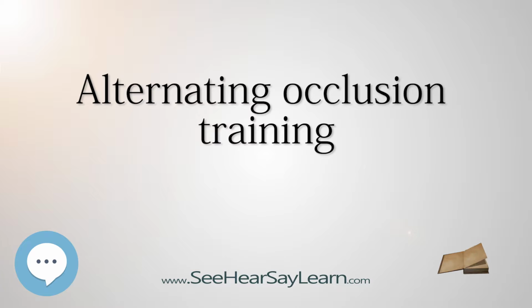Flicker rates. The flicker rates at which the occlusion is alternated between the two eyes in alternating occlusion training are generally much slower than those employed by the widespread active shutter 3D glasses for viewing 3D television or cinema. Therapeutic procedures have been proposed in which the active eye is switched after a duration of many seconds, for example, with an on occlusion duration of 40 seconds and an off state open duration of 20 seconds of each minute. Others propose a much faster flicker rate of approximately 5 Hz.